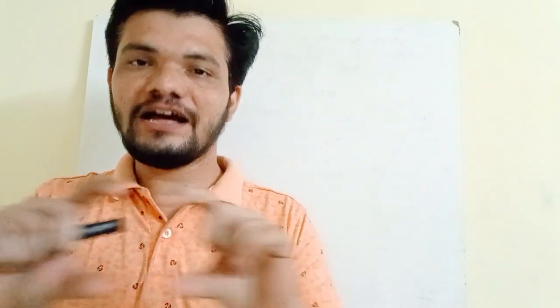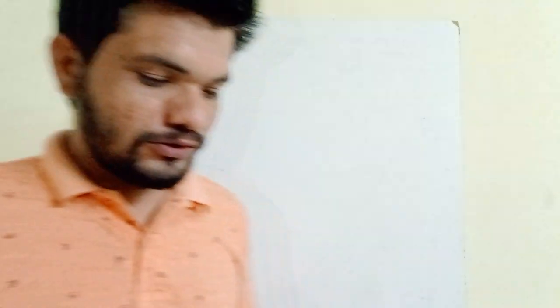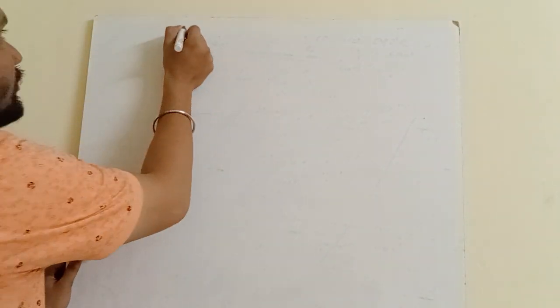In this video, we are going to discuss the electrocardiograph and what an electrocardiogram is. These two are different things. The graph is the machine, and the gram is the graphical representation of the electrical activity of your heart. So let me give just a heading.